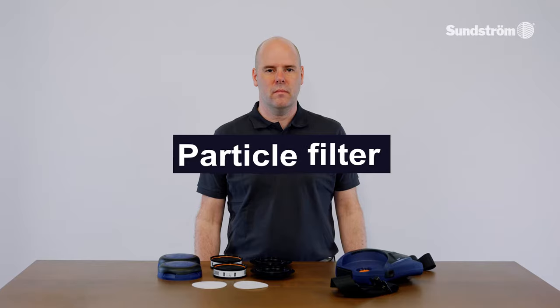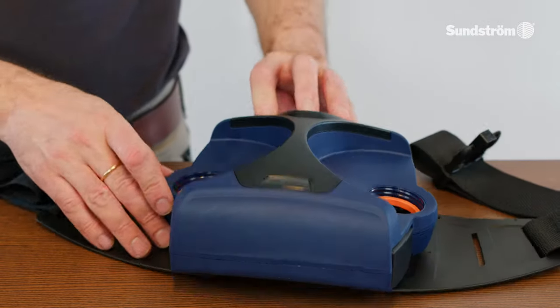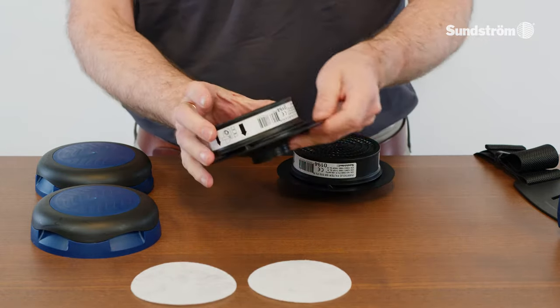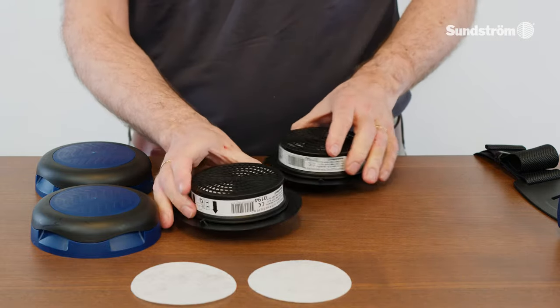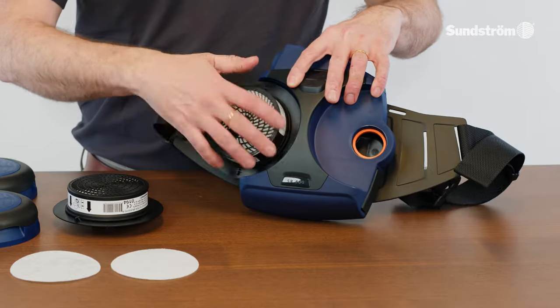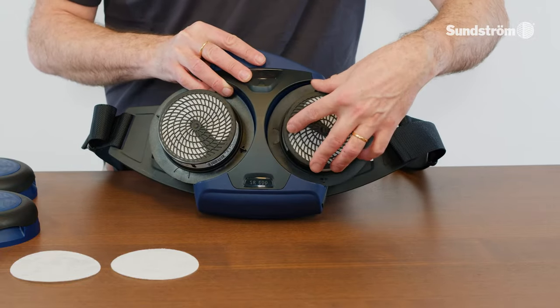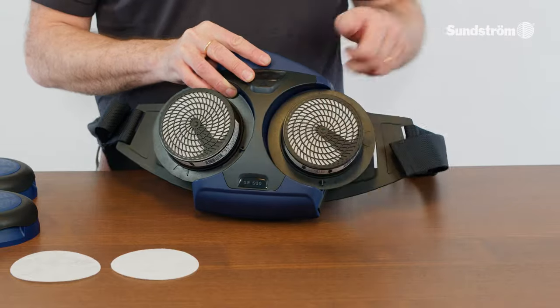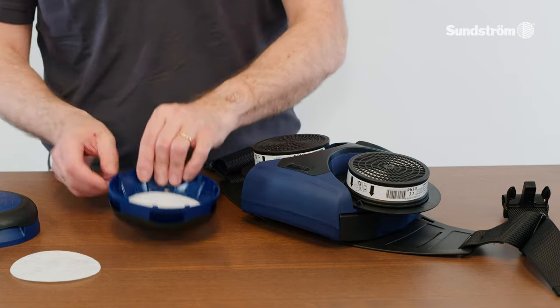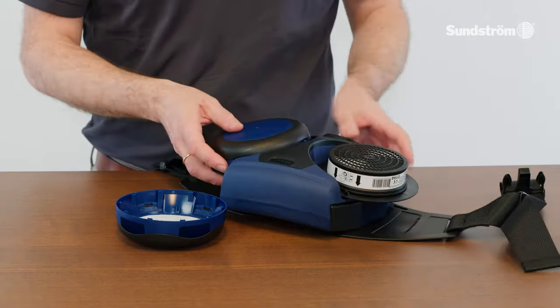Particle filter. Check that the gaskets are in place and in good condition. Snap the filter onto the filter adapter. Do not press into the center of the filter — it might damage the filter paper. Screw the adapter into the filter mounting, then turn it about 1/8 of a turn further. Fit one pre-filter into the pre-filter holder.